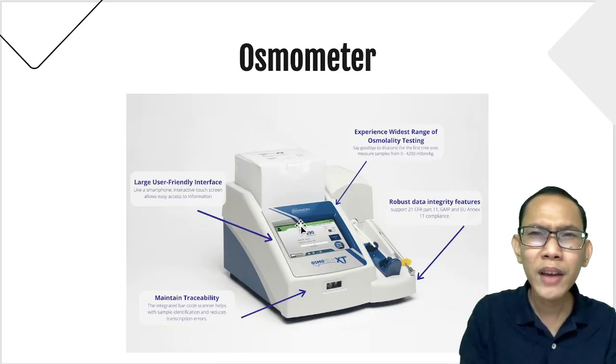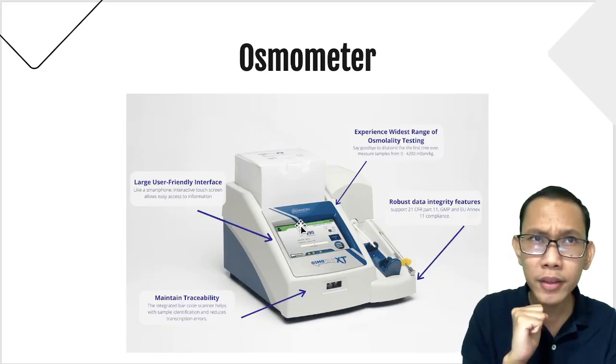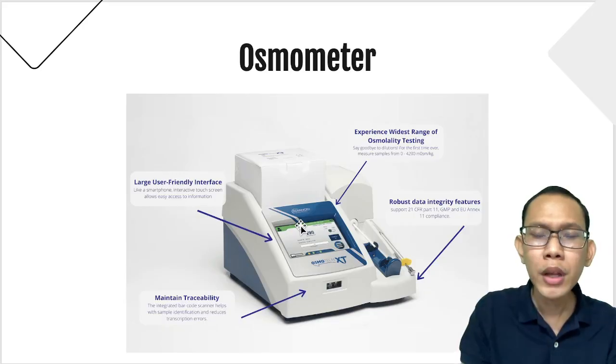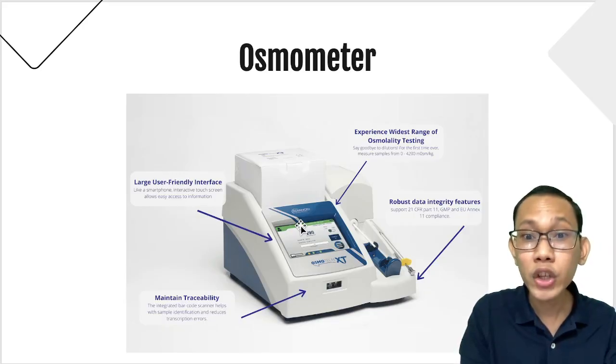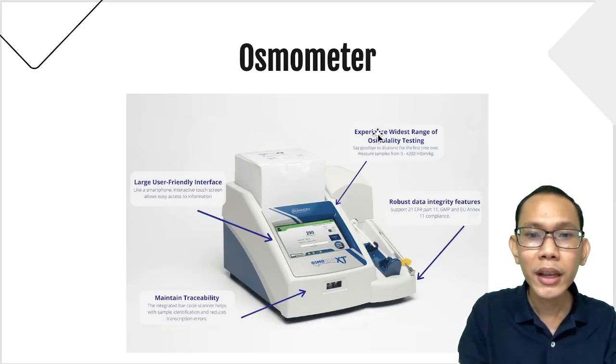Don't worry, you will have a discussion with your osmometer when you reach your clinical chemistry 2, sa discussion sa lab ng electrolyte, water distribution, kasi you will have to be able to identify the osmolar gap. You have to compute for the osmolar gap, and then yung osmolar gap can be determined, pwede siya calculated or measured. Yung measured is based sa ating osmometer.